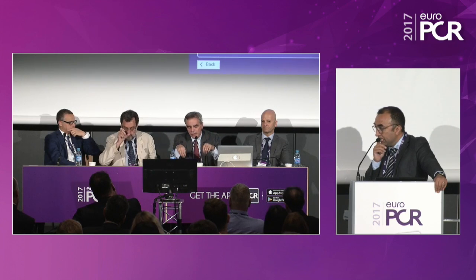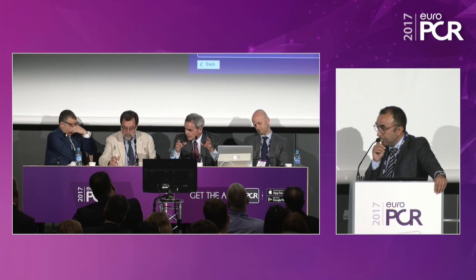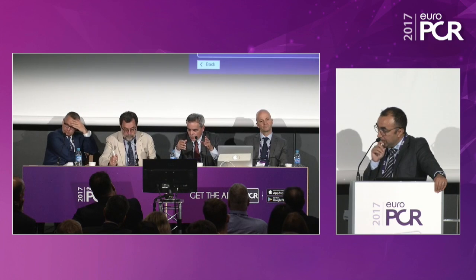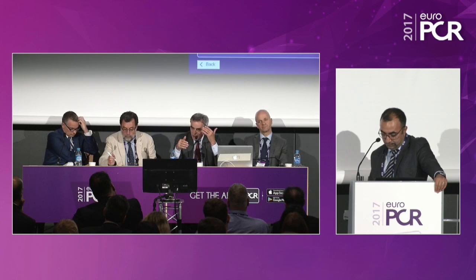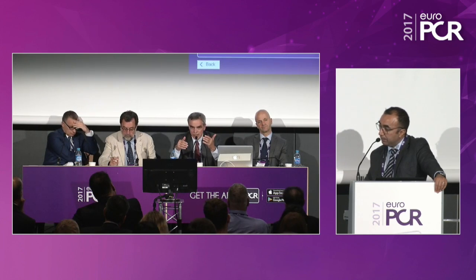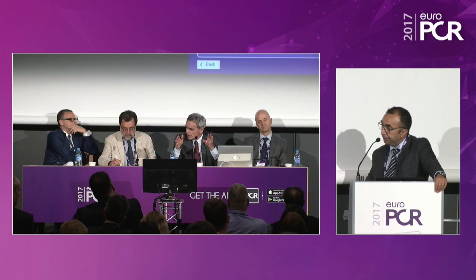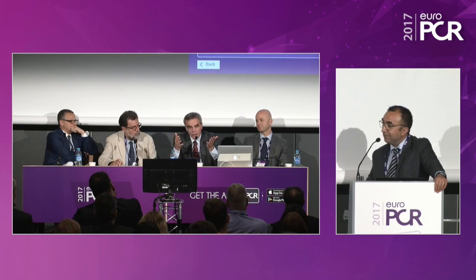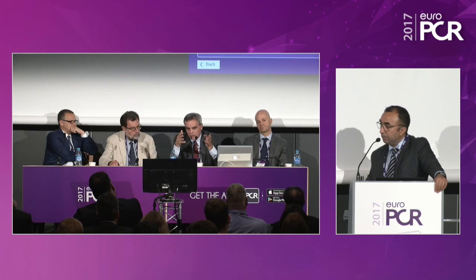So at this point, I think if a patient is technically feasible, if it can be done, I would always start doing the case, and we still have to learn beyond surgery what is the right dimension of the LV, what is the right angle of tethering, what is the right annulus size. And I think the numbers will be completely different from what we have learned so far from surgery. So I'm very open-minded, and I do whatever I can do. And I think that's the message, at least from my learning, that we cannot exclude a good response even in a patient where we might consider him not to be the perfect case.